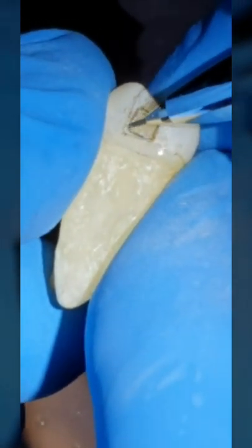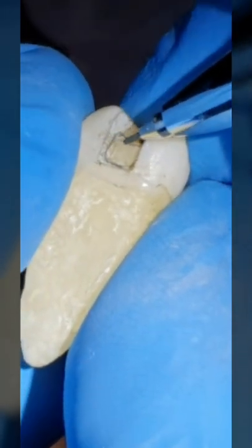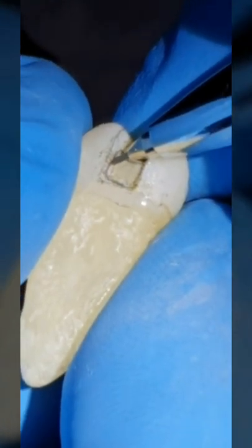The wall goes inside and the retention is into the dentin, then there is some dentin, and then you have enamel rods up on top left. Do not put the retention into the enamel rods; they would be unsupported and then they'll break off. The retention has to be into the dentin.